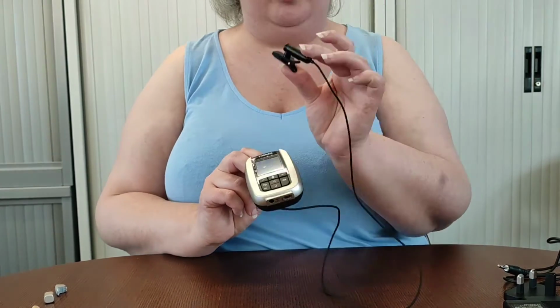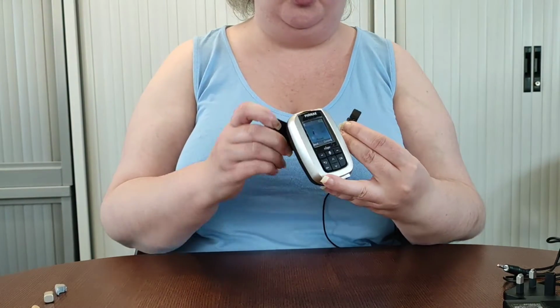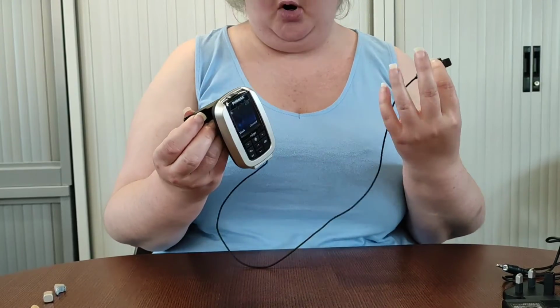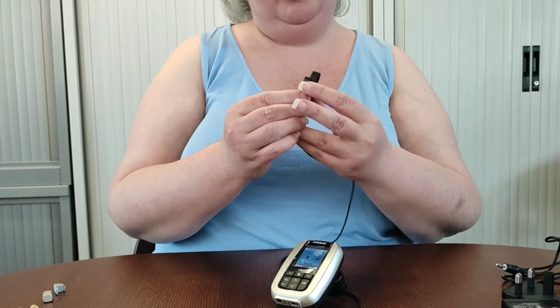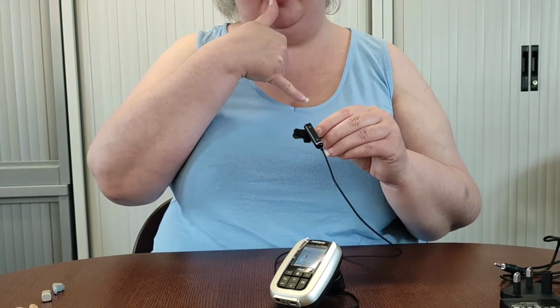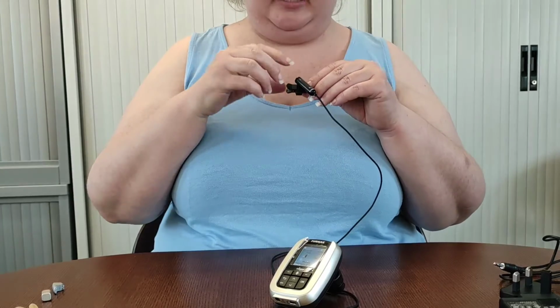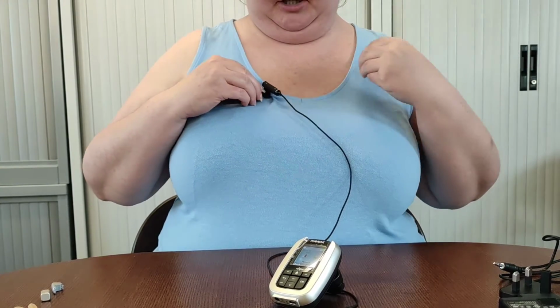We also have the microphone that is attached via a lead. Now this is so that you can clip this onto maybe your belt or somewhere, put it in your pocket, depending on the lead length. And this actual microphone needs to be clipped a handspan from your mouth. So if you put your thumb on your bottom lip, where your little finger lands, that's where this should be clipped, and we can clip it on as such.